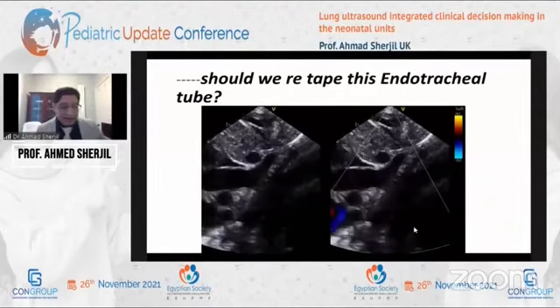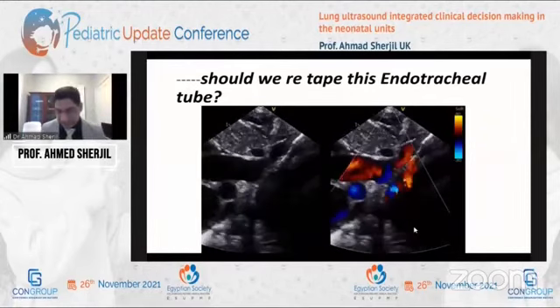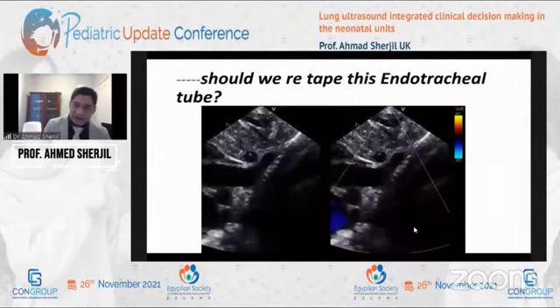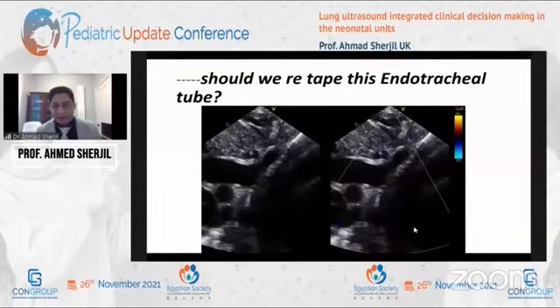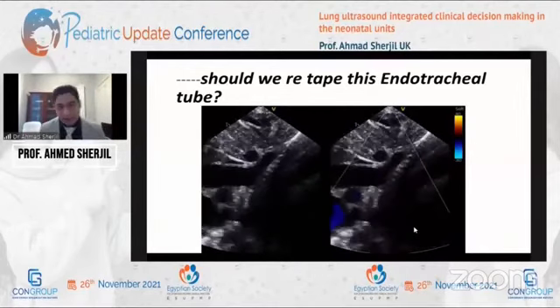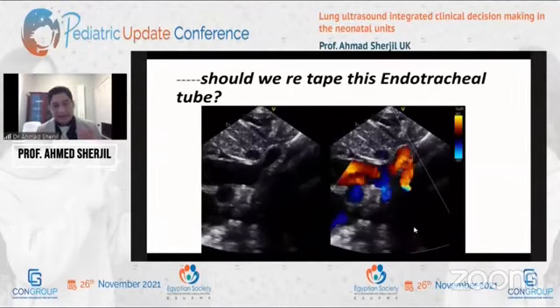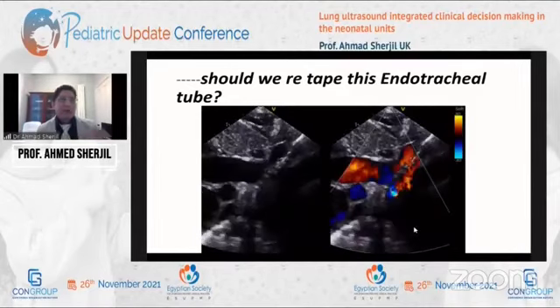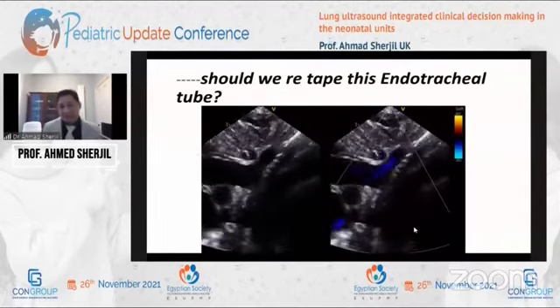So accidental extubation is a big problem in every way. Some places you don't want accidental extubation. A nurse comes to you and says, I think this baby is going to, the tape is loose, the ET is mobile, it's going up and down with movement, and what are we doing about it? I found the tape okay, but yes, with the movement, opening of mouth and movement, I could see the ET became more visible and invisible, kind of causing a fright that it may come out.